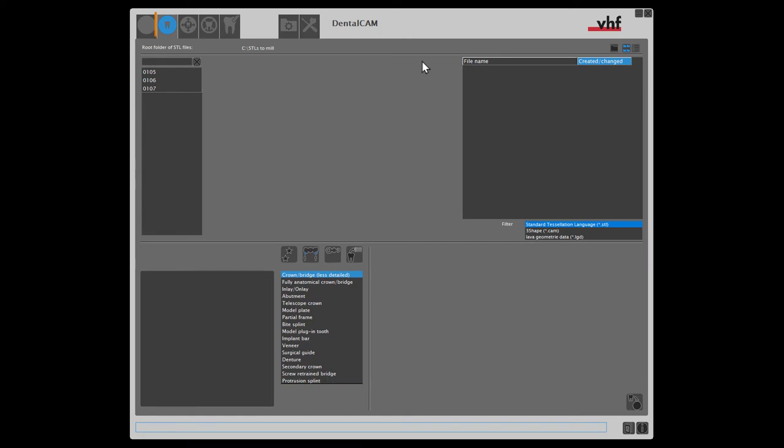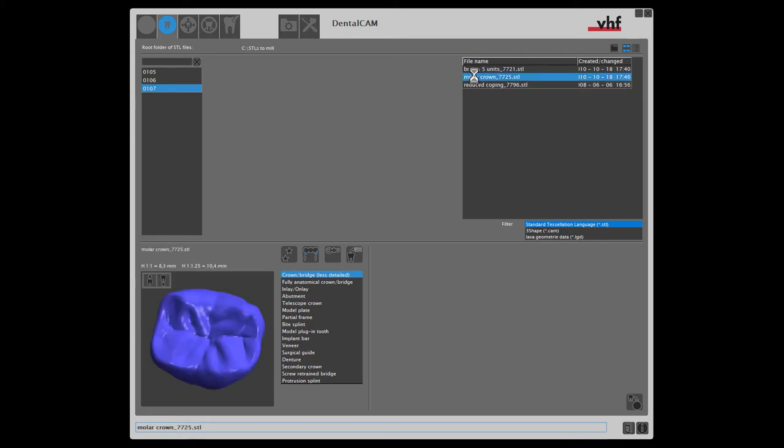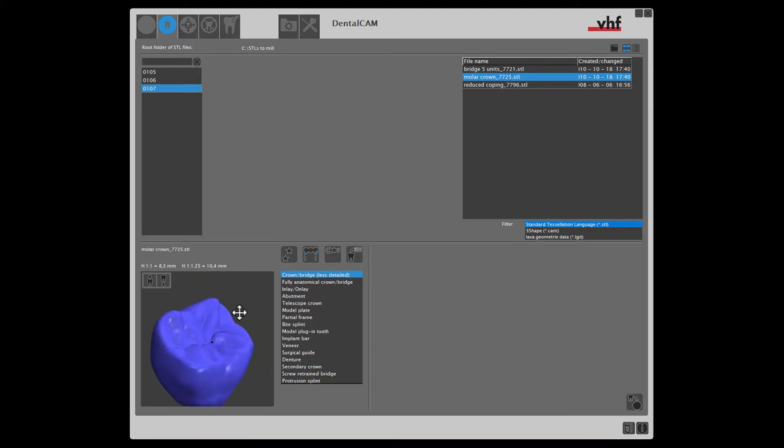Now the import view displays. Here we first select an STL file. The preview window gives you a three-dimensional view of the selected file.